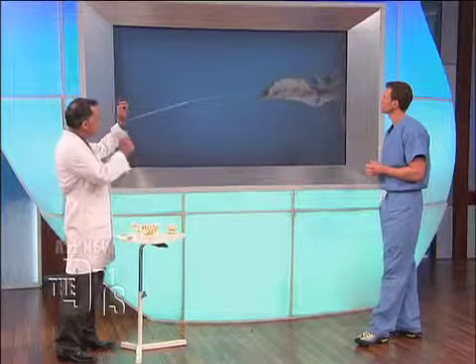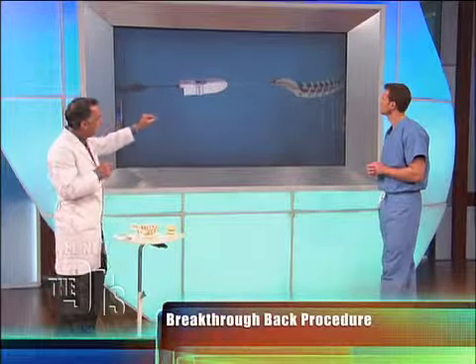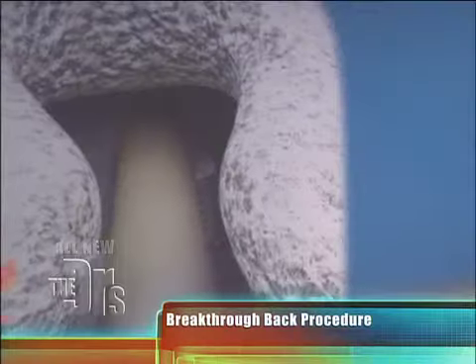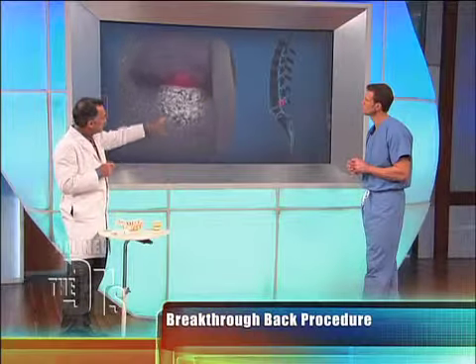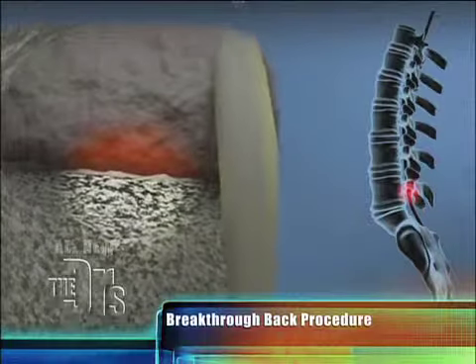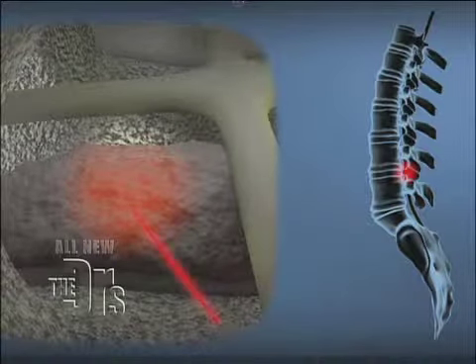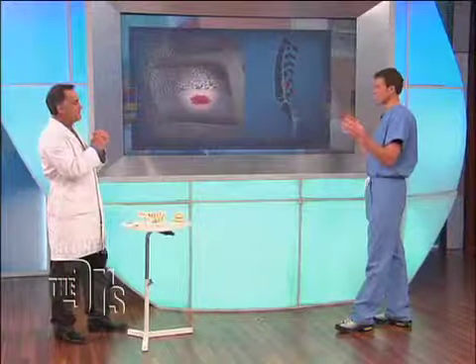The AcuraScope procedure is a laser procedure going through a tiny little scope that goes in what we call the natural opening of the low back — just a small skin nick. It actually goes into the spinal canal and passes up to where we see the herniated disc. The little red line coming out is a laser treatment of that disc. So you're disintegrating the slipped disc with laser rather than traditional surgery.